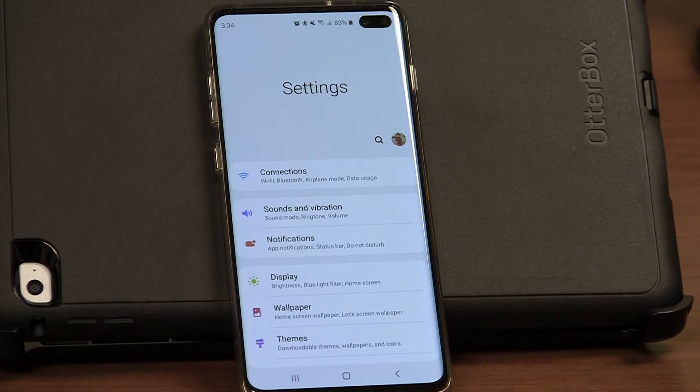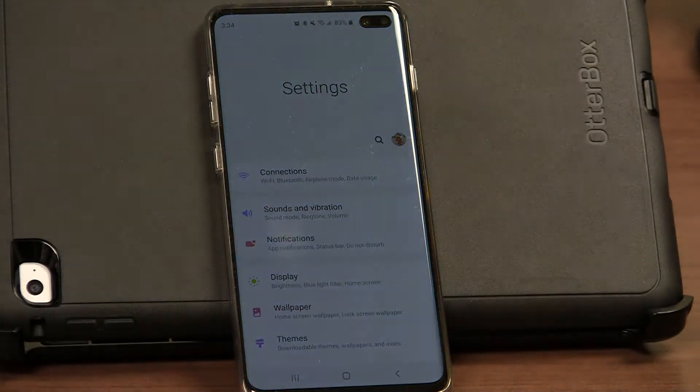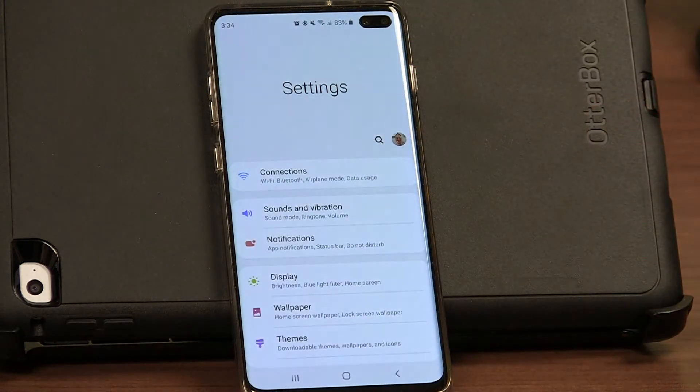I'm going to show you how to set up a Bluetooth hearing aid into an Android phone for connectivity. It's important to note that there are two different types of compatible hearing aids. Some are made for iPhone, some are made for all or made for Android. They're going to connect slightly differently. This one is not made for iPhone — it's made for all or made for Android devices.